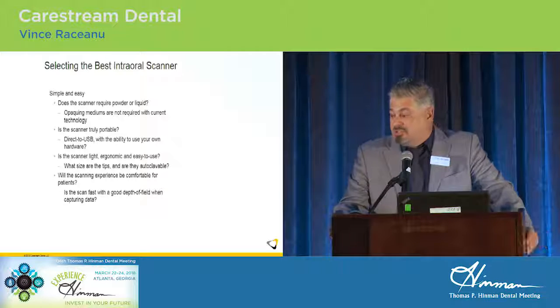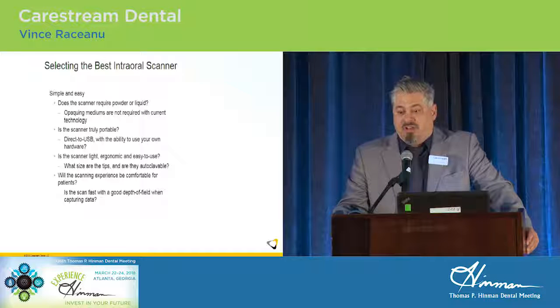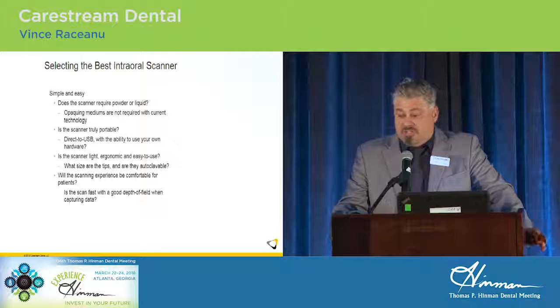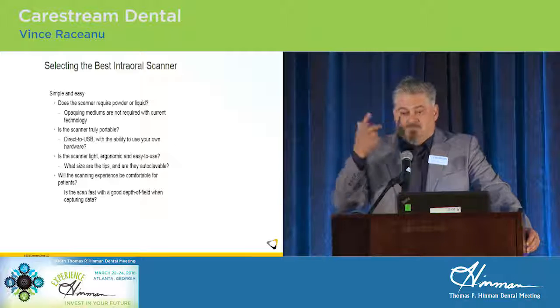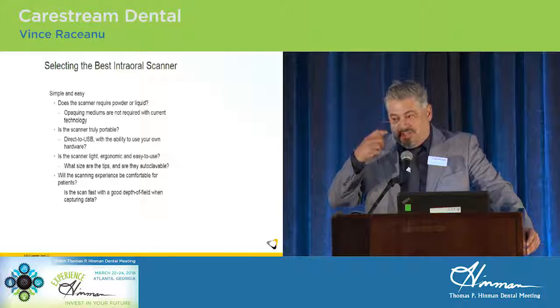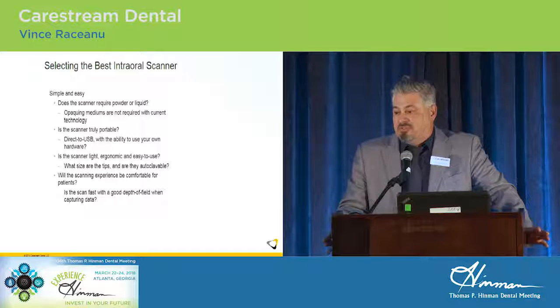It is just really a simple unit to pick up and go and learn so that you can experience a 2-minute impression. That's the goal, to be able to do it all in 2 minutes, upper, lower, bite, the whole thing, right? Full mouth I'm talking about. If you're doing a single posterior zirconia crown on number 30, all you need is the quadrant, the antagonist, and the bite, and you can move on, and that's much faster.